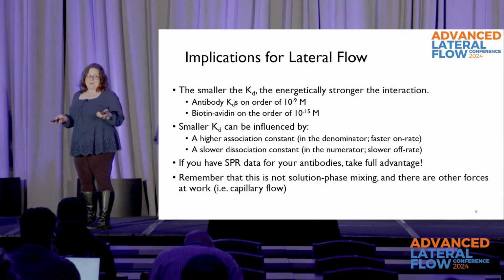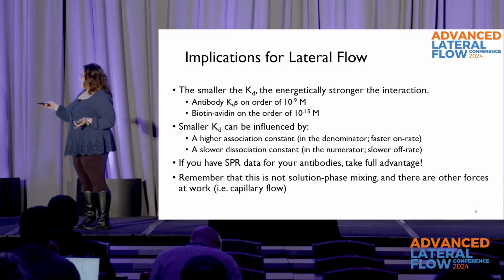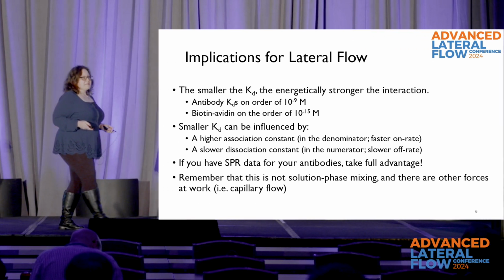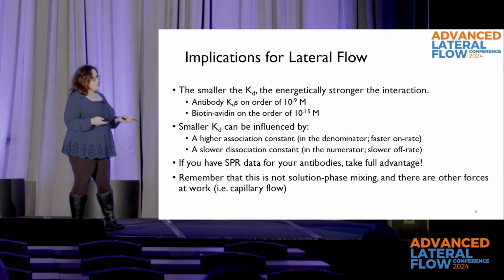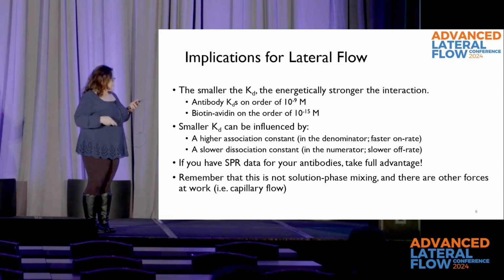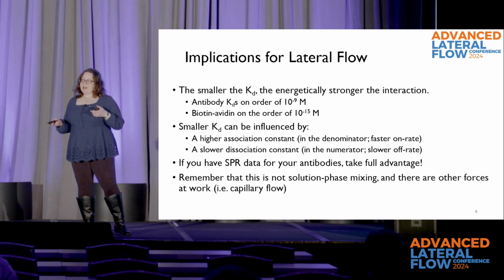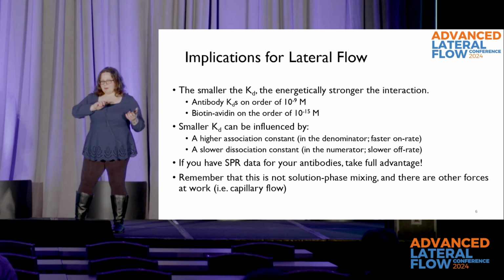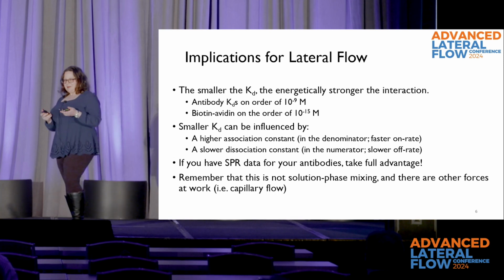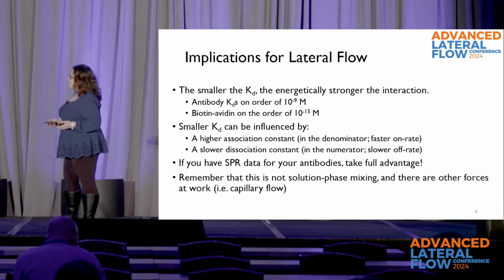So this is something, and I promise I did not plan this, but Klaus is talking about SPR for the next talk. And I'm here to tell you, if you have SPR data for your antibodies, this can really help you. It's helped us at DCN before. It's a really nice thing to have. What we also have in lateral flow, I want to caution you, is that it's not solution phase mixing. You have a lot of things going on here. There are capillary forces pulling everything up as it's mixing. So there is mixing going on, but it's mixing with direction, mixing with flair.